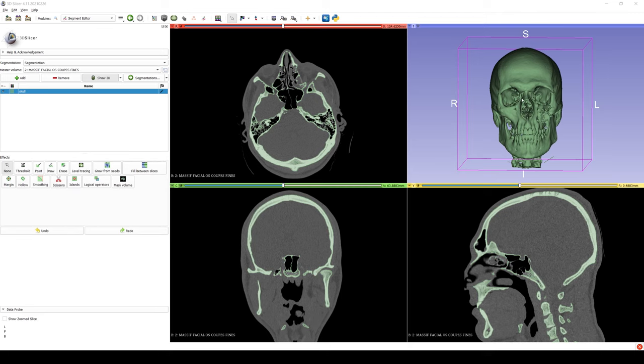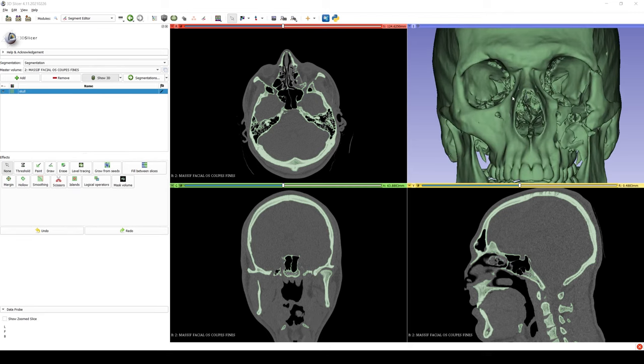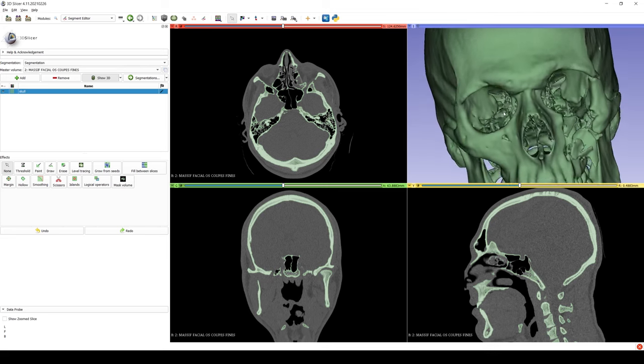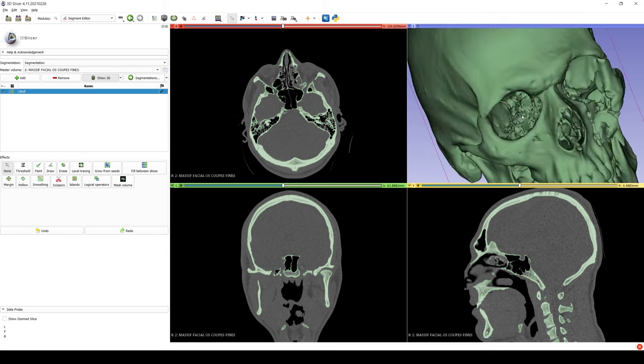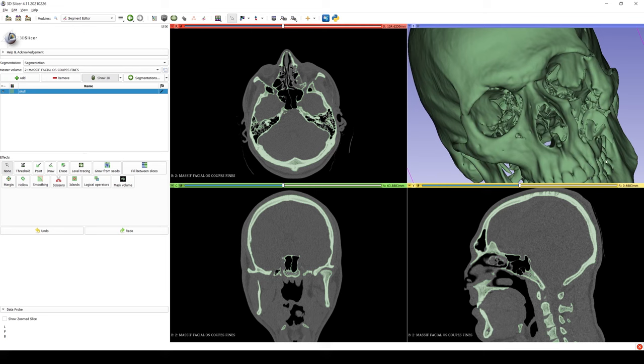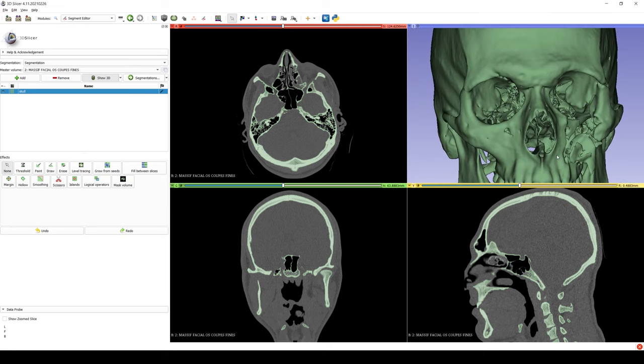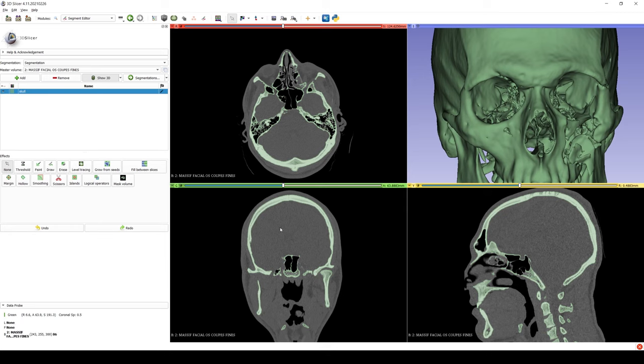So now I'll show you how to select very thin bone, like the orbit for example. You can see here that the orbital bone was so thin that when we selected 350 for the density, it was not included in the 3D rendering technique. So let's say you want to select the right orbit to eventually reconstruct the left orbit, here's what you can do.